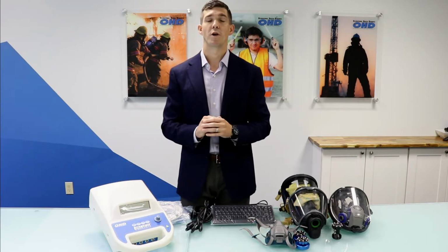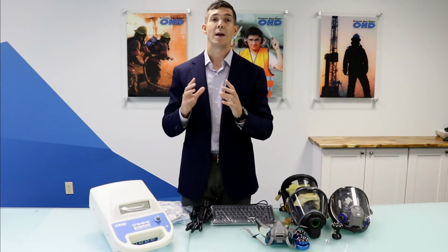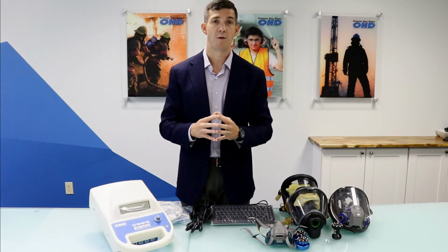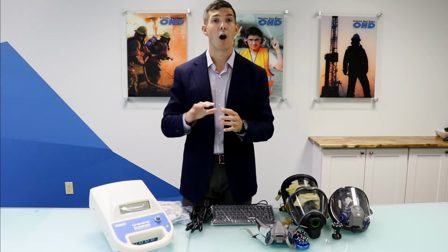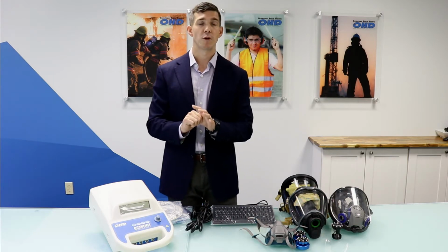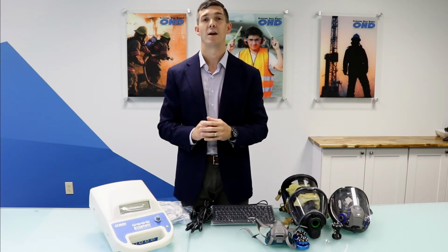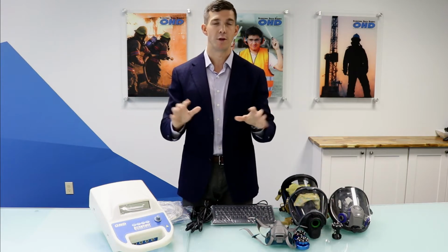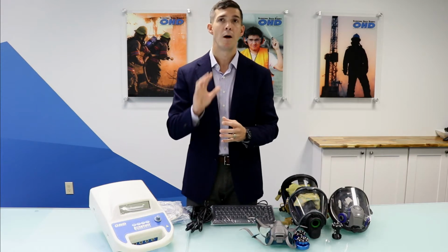One major difference with our technology in those two standards: the OSHA standard requires a 500 fit factor for full face respirators, and the ISO standard also requires a 500 fit factor for full face respirators. There is a different fit factor for other technologies, and you can look into your standards there, but it's important to remember that on full face respirators with controlled negative pressure, it's a 500 fit factor in both standards, and with a half mask respirator, it's 100, and that's pretty much commonplace across all regulations and guidances actually. But always check out the guidance you're using and really understand it fully.